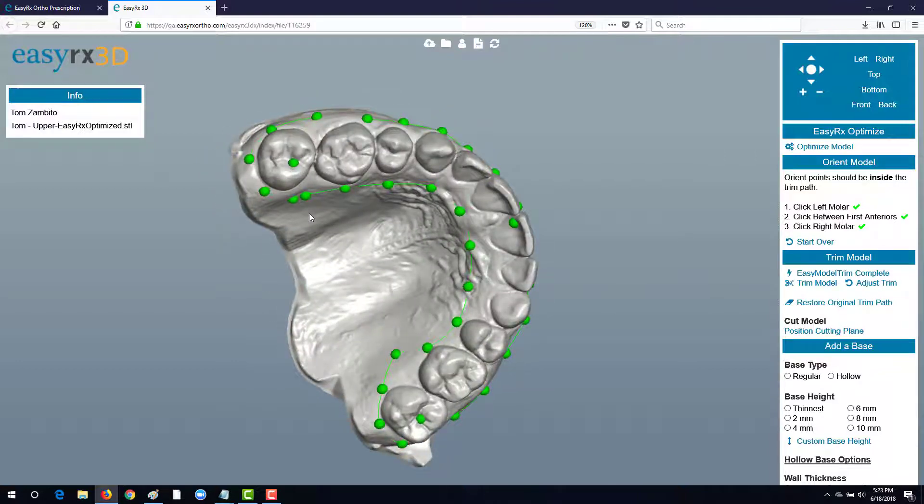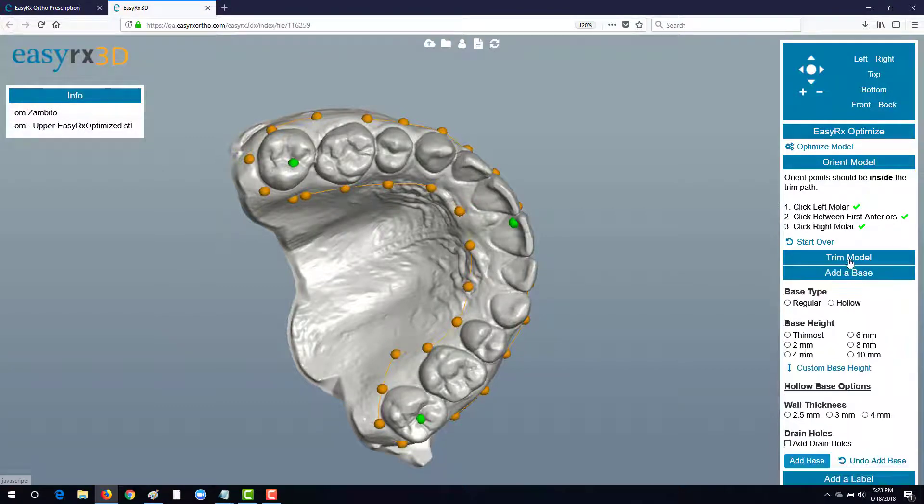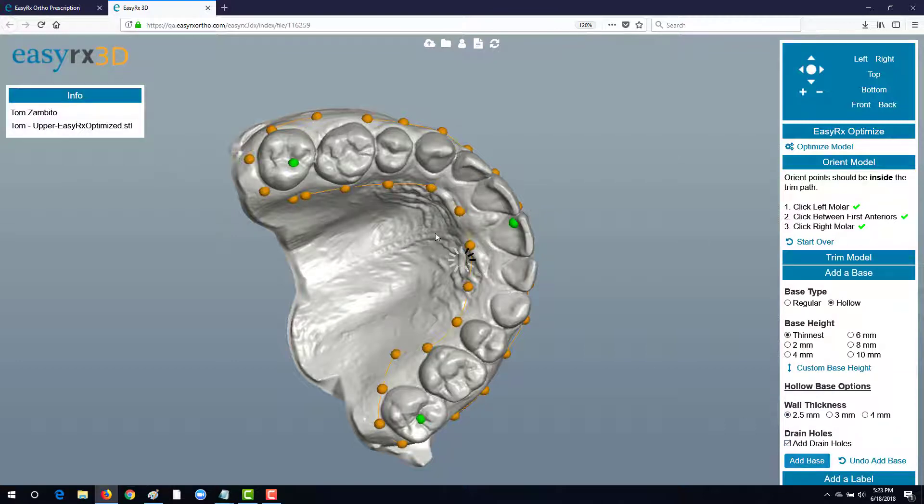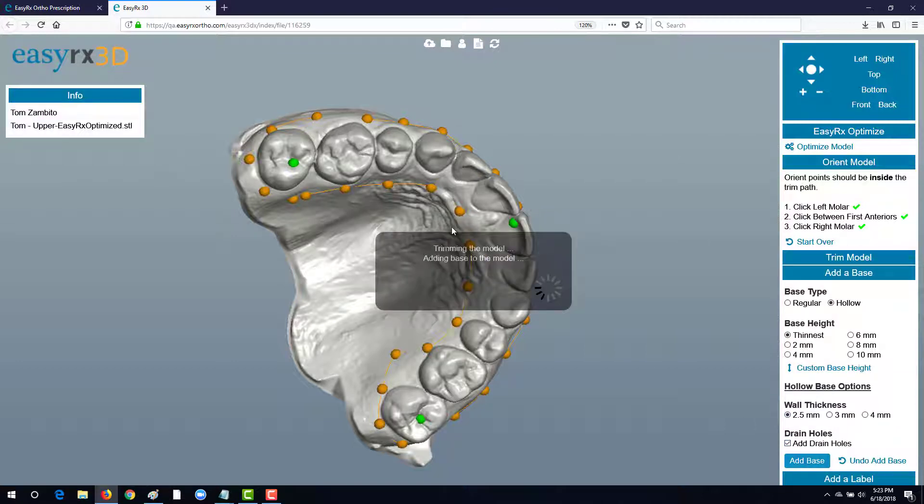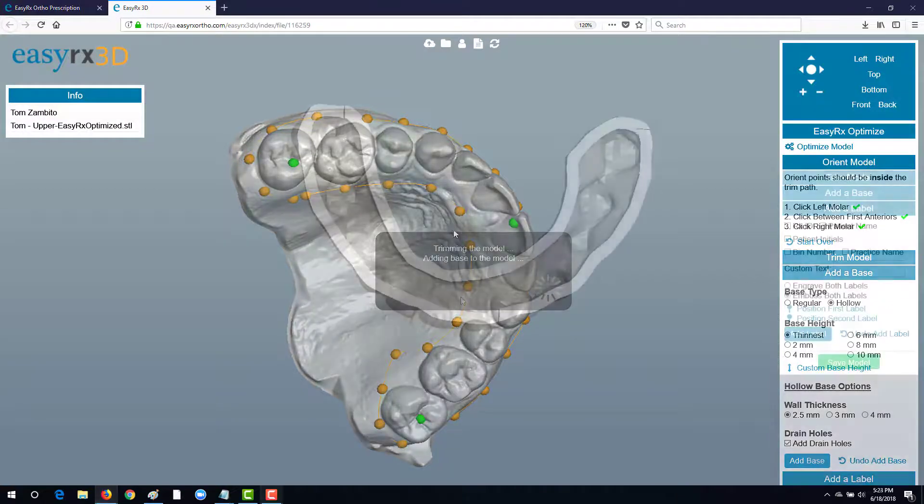After the dots are all connected, the trim path is complete and we can now choose a base. We'll select the base type, height, and thickness as needed and just add base which will base and trim at the same time.